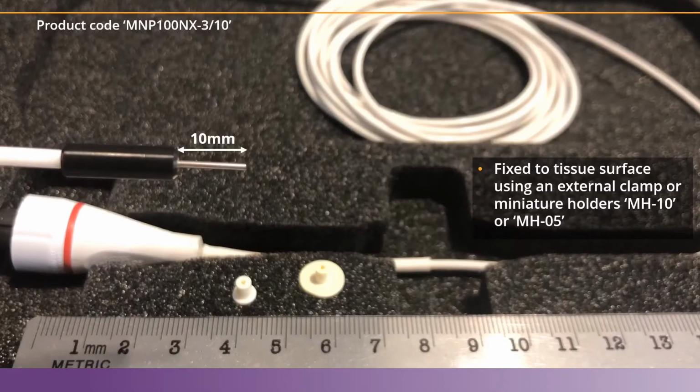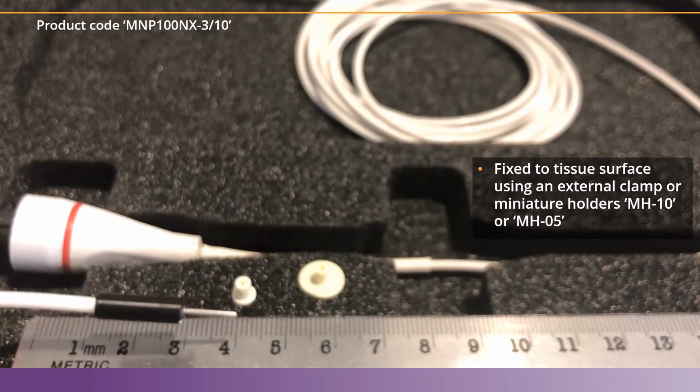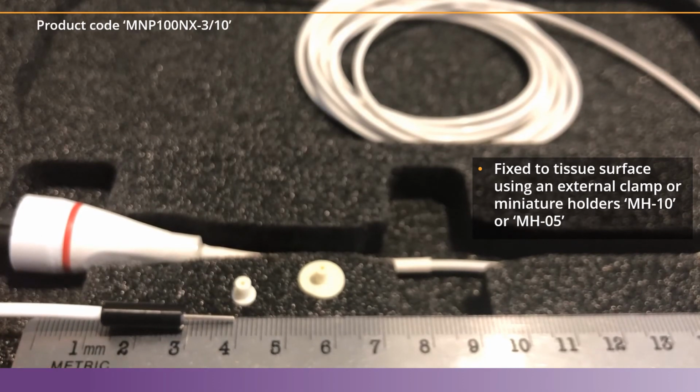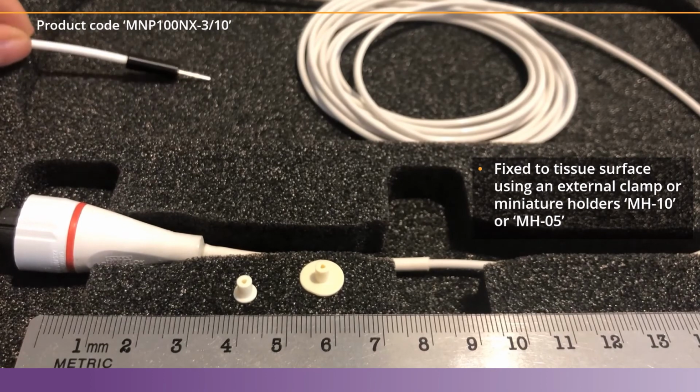The needle portion is 10 millimeters long, or 1 centimeter, and the diameter is 20 gauge, or 1 millimeter. The collar length is 16 millimeters with a 5 millimeter diameter. The needle tip is blunt, so it won't cause any tissue damage if used gently to place the tip of the needle to the tissue surface. And the sampling area of this probe is approximately 1 millimeter cubed, but that is dependent on tissue pigmentation.